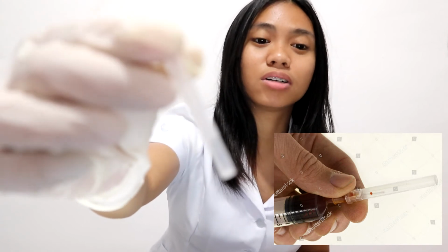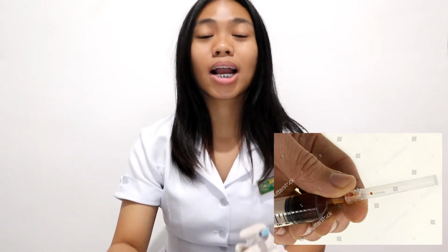Now, after doing so, secure the syringe by placing back the protective cover, this protective cover, by recapping. Always note that you should not recap while holding the cap because of the hazard it will give. Recap it by inserting the syringe into the cap.